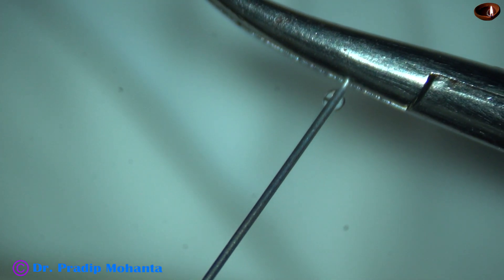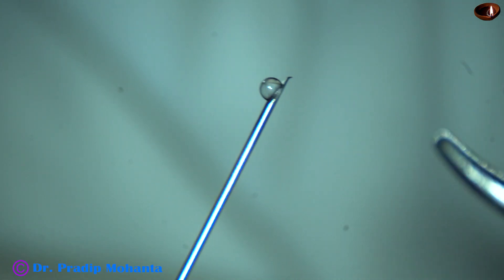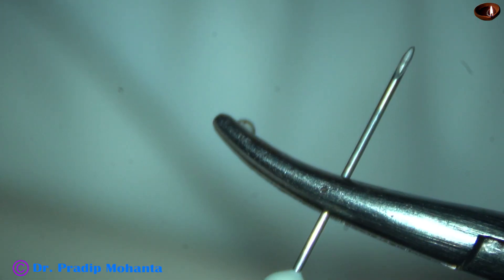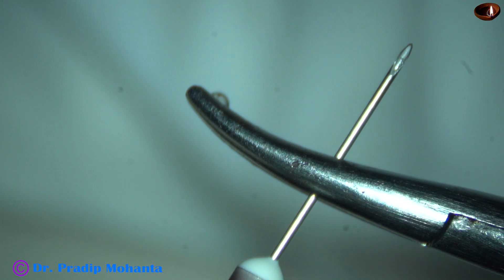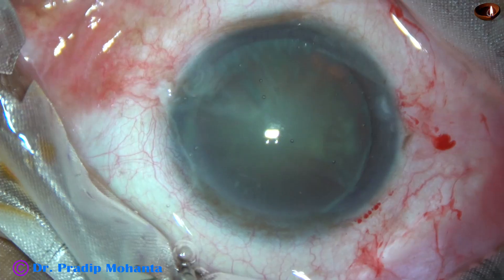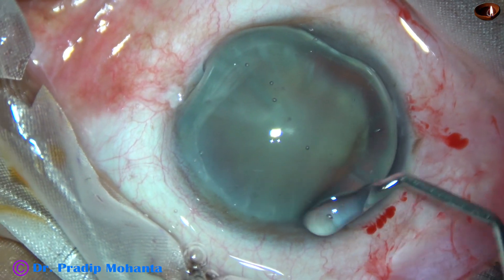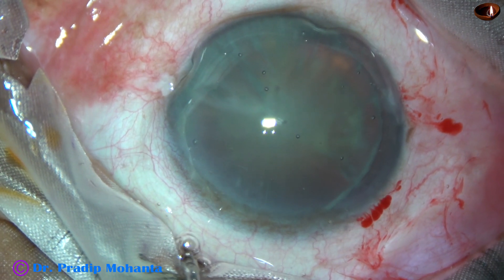And now make a cystitome by bending a 26-gauge bent needle, and this is for capsulorhexis. Beginners may find the needle more comfortable than Utrata forceps.